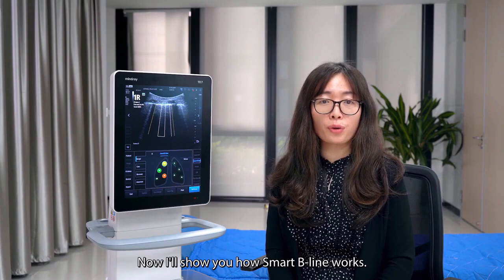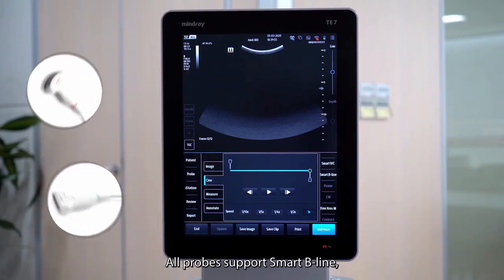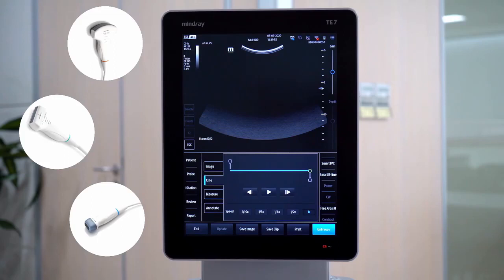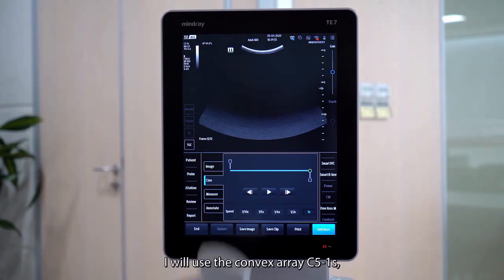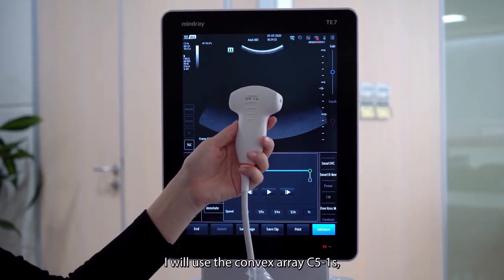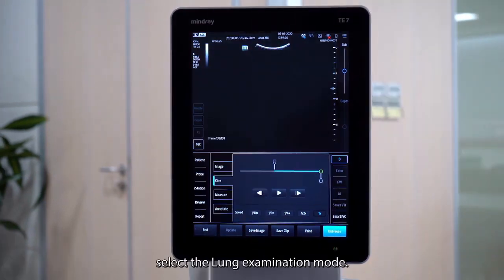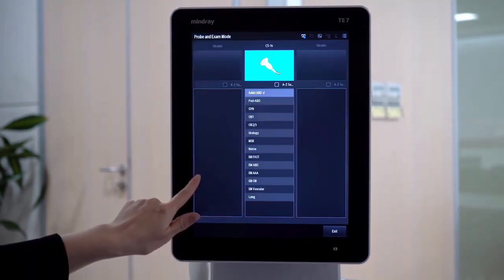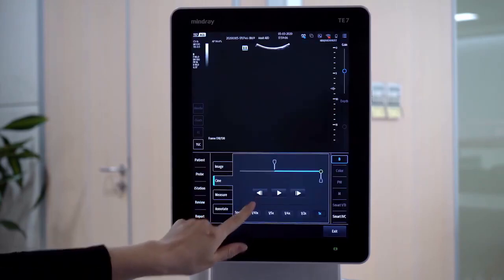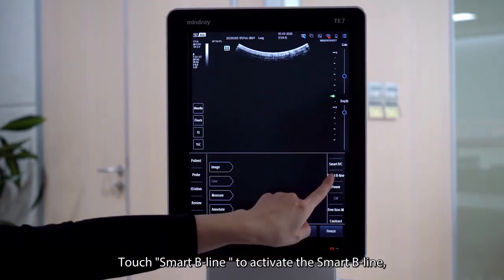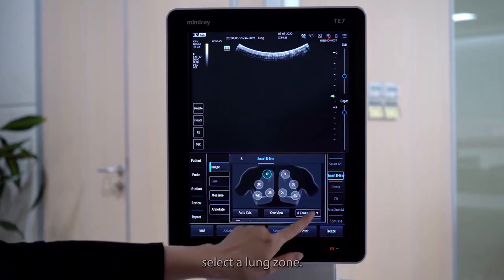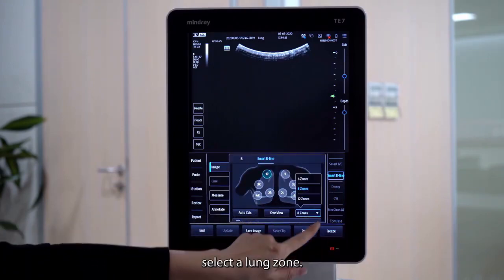Now I will show you how Smart B-line works. All probes support Smart B-line. In this demonstration, I will use the convex probe C5-1S. Select the lung examination mode, then touch Smart B-line to activate it.